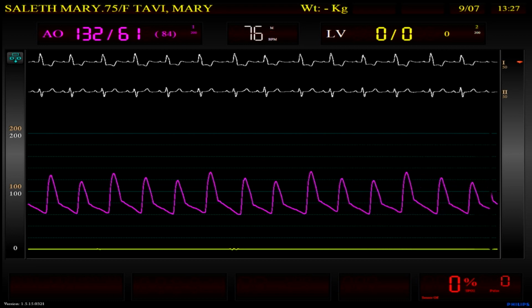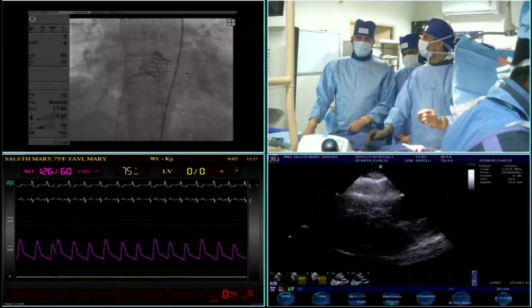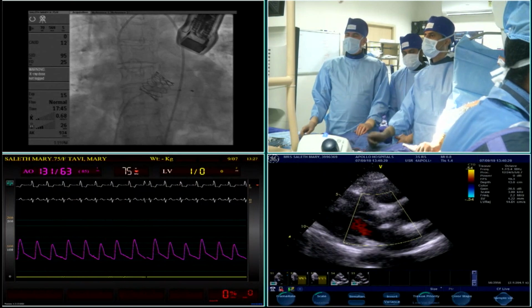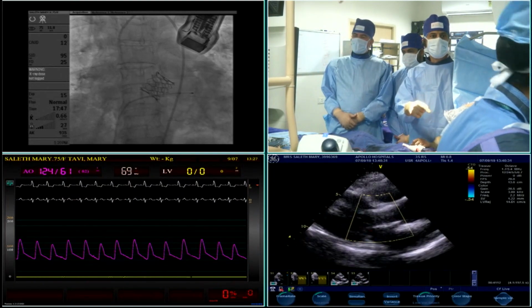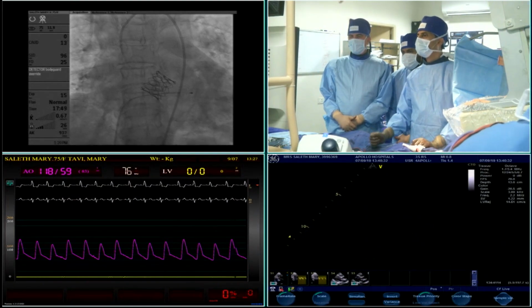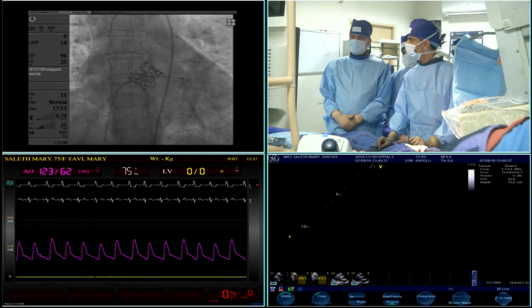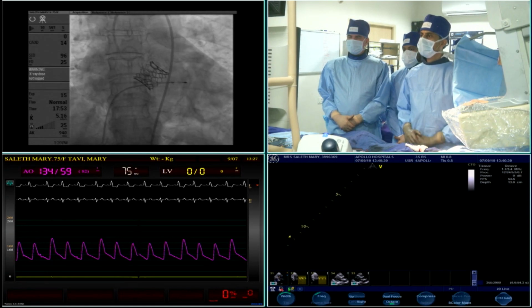Okay. So in which case, I think we can proceed to the aortogram. Caudal. Yes, please. We need to remember that one of the issues that we raised in advance was the relatively low left main stem origin. So it'll be interesting to see the flow down the left main. Okay, ready? Can you make it a big screen?